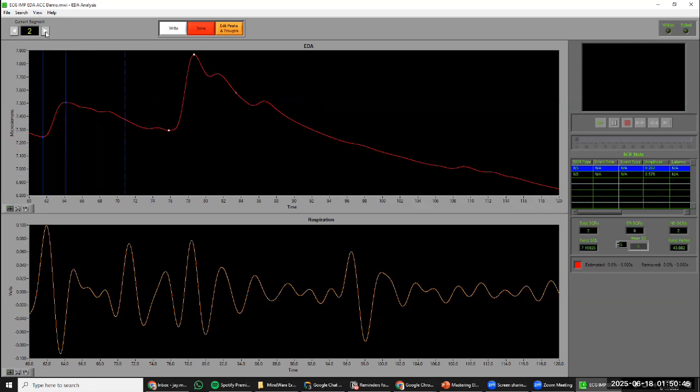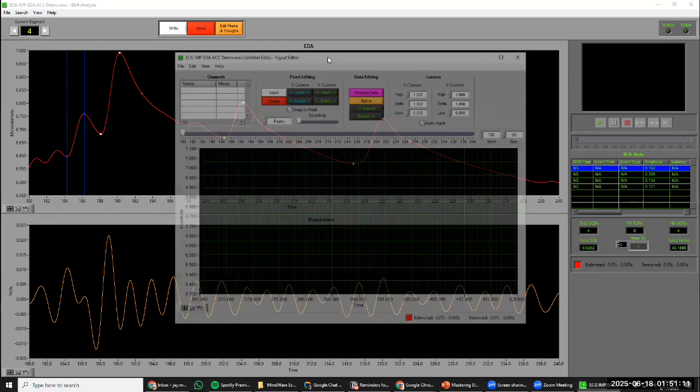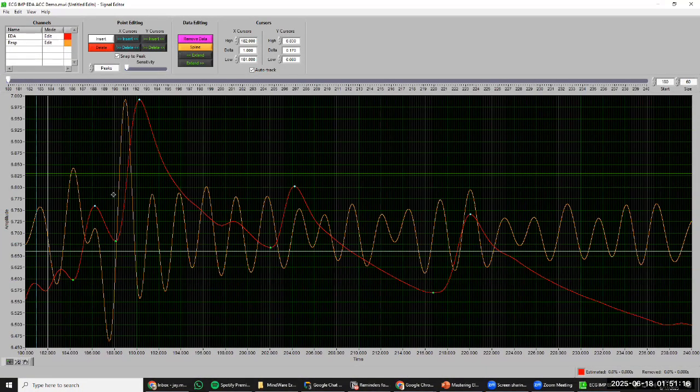But in further examples, we will see that there is a spontaneous large respiration that is certainly within that criteria of being about 2 or 3 times in total magnitude, from trough to peak, compared to these. And so we just want to look at this a little bit closer to see if this particular change, again about 1 to 3 seconds afterwards, falls within that window of this respiration. So we're going to hit the Edit Peaks and Troughs section here. And what we're going to do is look at the different points between these, actually focusing on the trough location.